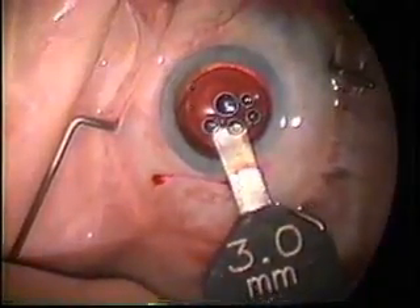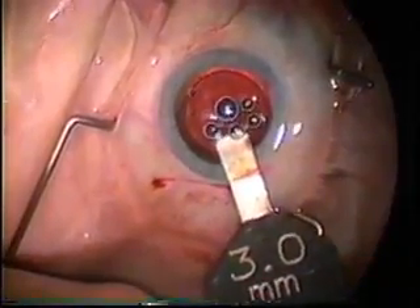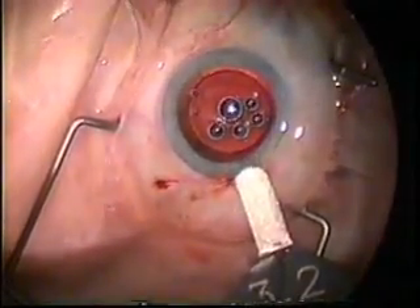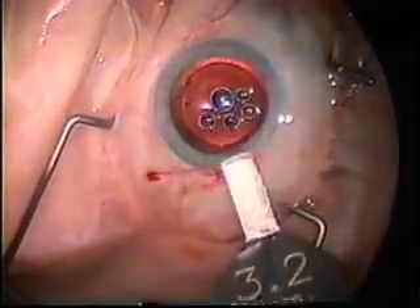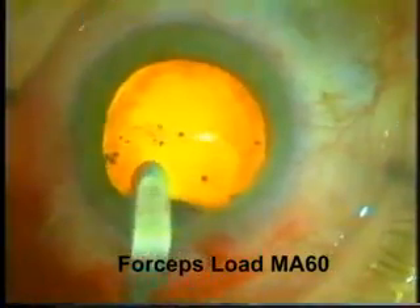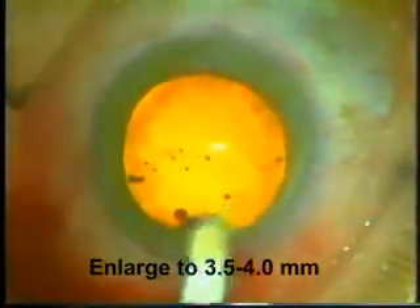Following placement of the wound, the wound was checked for its size. A 3 millimeter fits, as you would expect, but a 3.2 millimeter doesn't fit — this reminds me of the O.J. Simpson glove, where no matter how hard we tried, we just couldn't get it to fit. When you use a forcep to load the three-piece lens, you have to make the incision bigger, 3.5 or 4 millimeters or so.